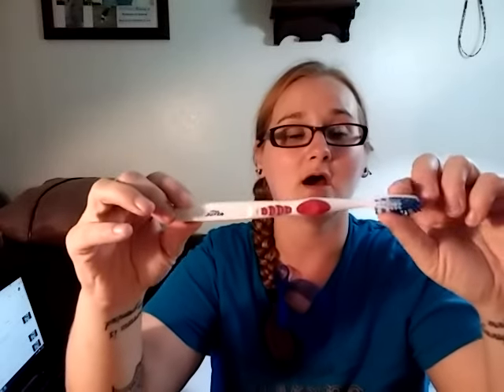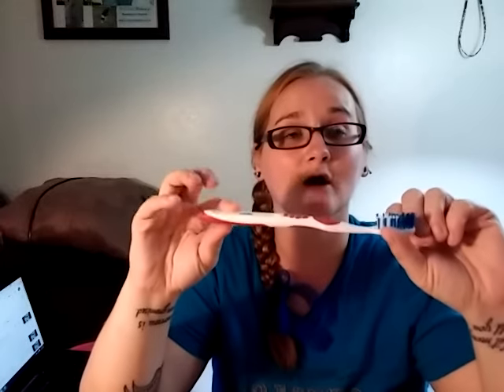And then this is just a soft bristle brush that I use. I have two of these, actually. I use one on my dentures, and one on my gums. And then I just use Colgate toothpaste to brush my gums in the morning and at night to help stimulate my gum health. That's something the dentist told me to do, and I do that before I put my teeth in in the morning, and after I take them out at night. So I have a red toothbrush and a blue one. The red one is the one that I use on my gums, and the blue one is the one that I use on my dentures.